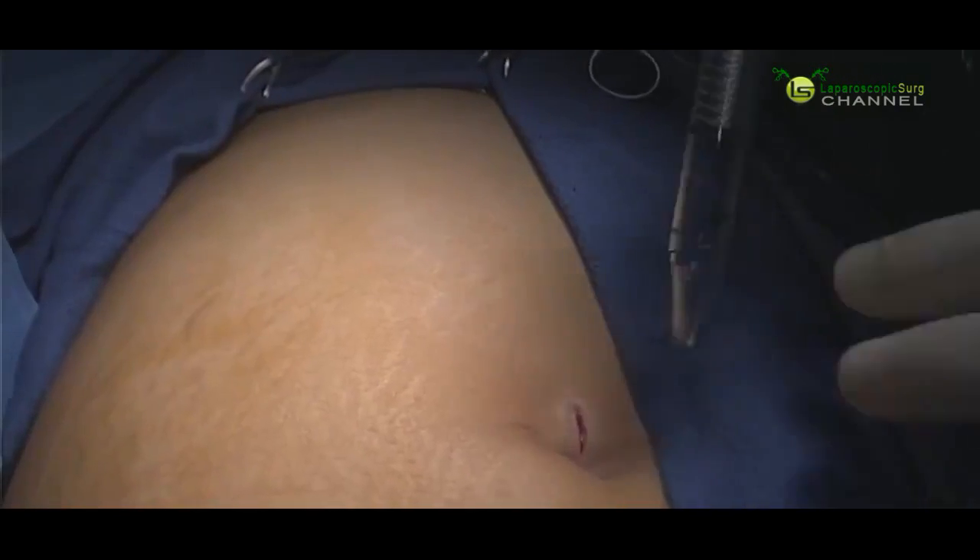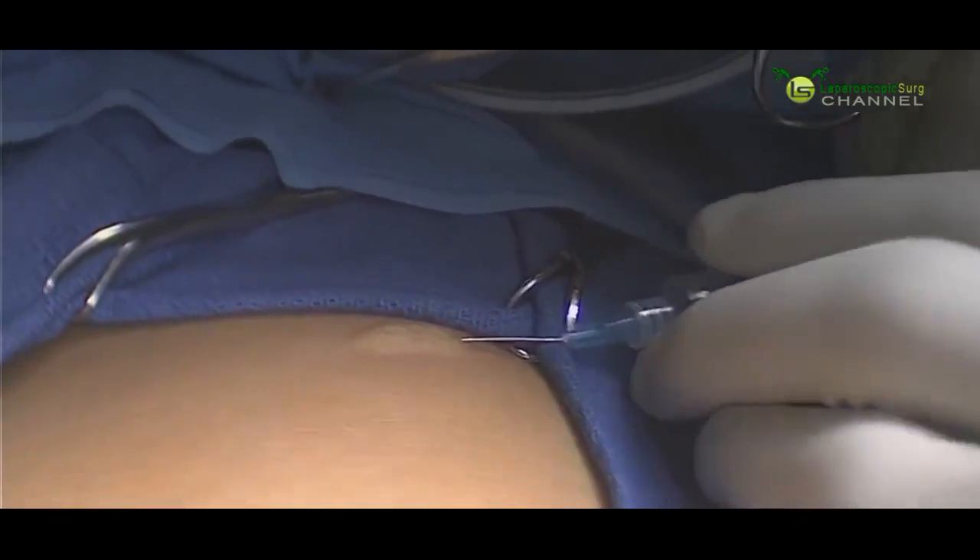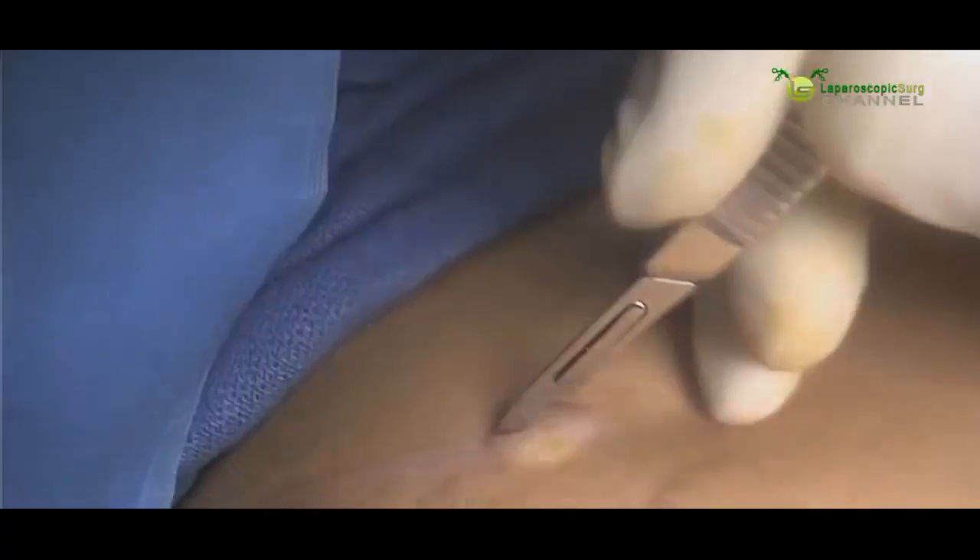We're going to make an incision at the umbilicus and then insert a trocar. We'll place our camera down the trocar so that we can see it as it goes into the abdomen. Once we're inside, we inflate the abdomen with carbon dioxide and then numb the skin so we can make our other three incisions.